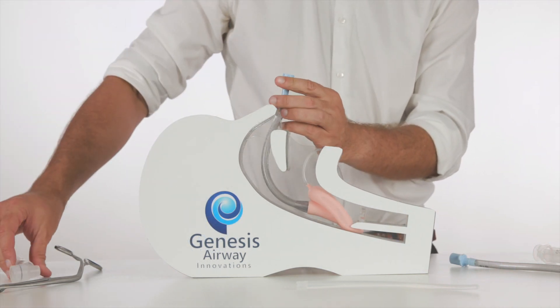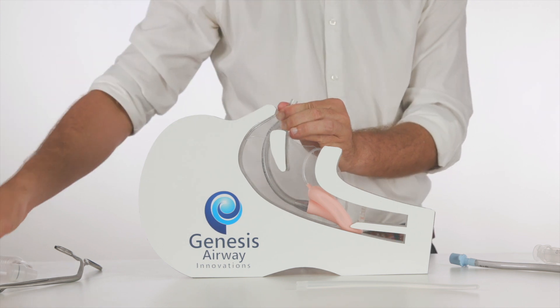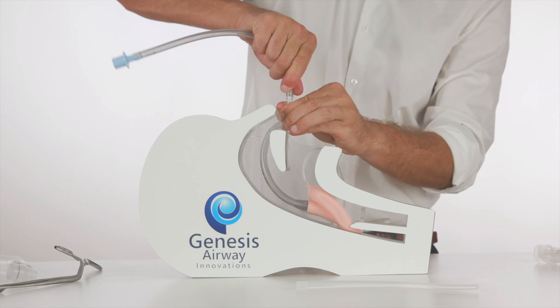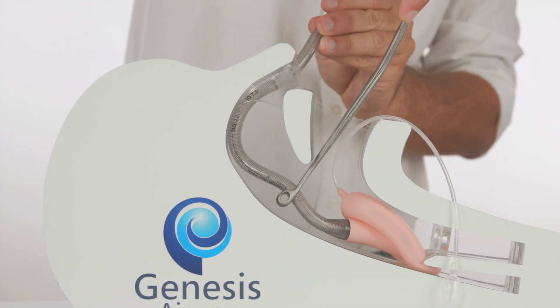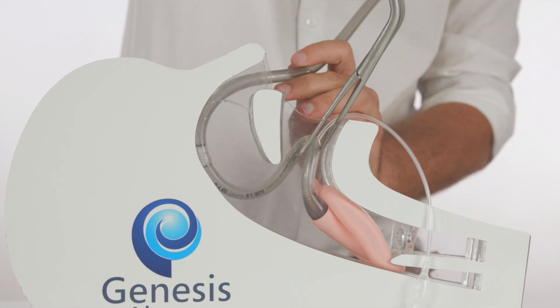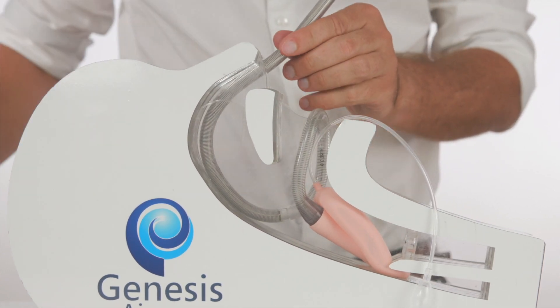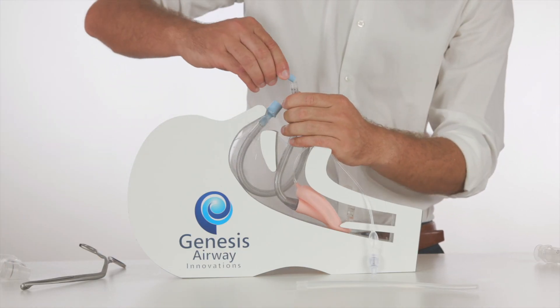To reverse the procedure, the 15mm connector is removed and the extension tubing is reconnected to the LMA tubing with a twisting motion. The LMA tubing is grasped through the mouth with McGill's forceps and with a pushing rather than a pulling motion, the tubing is retracted through the mouth. The two tubes are disconnected by twisting and the anaesthetic circuit is reconnected.